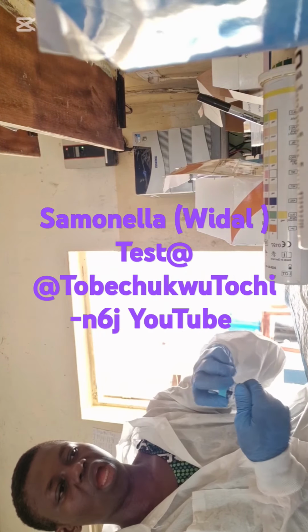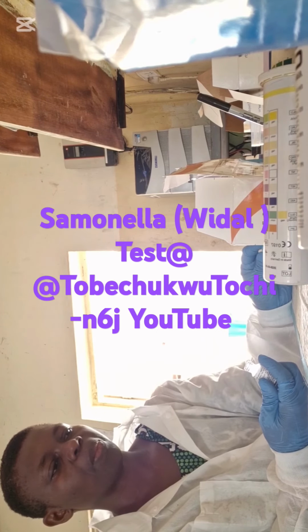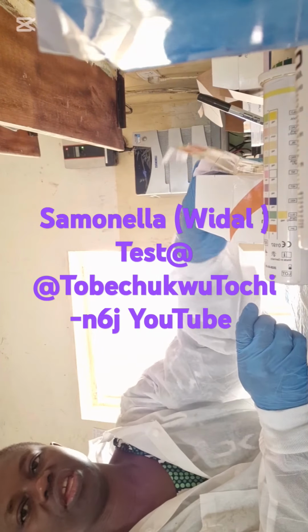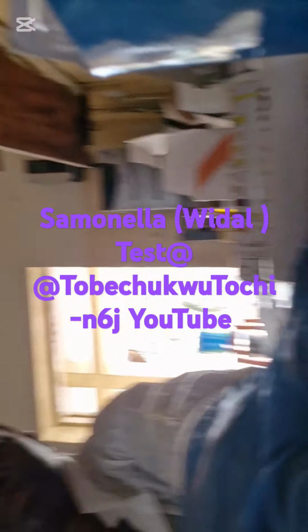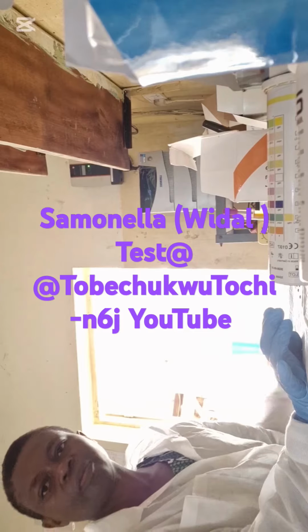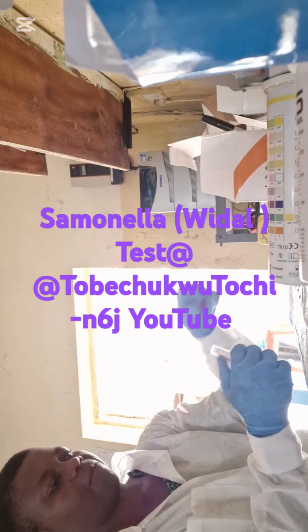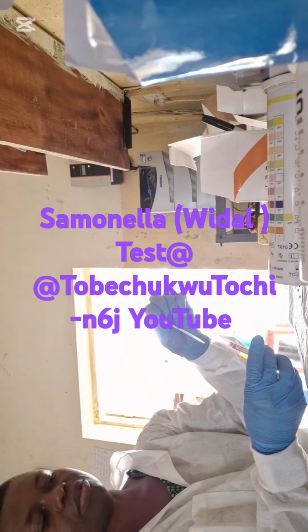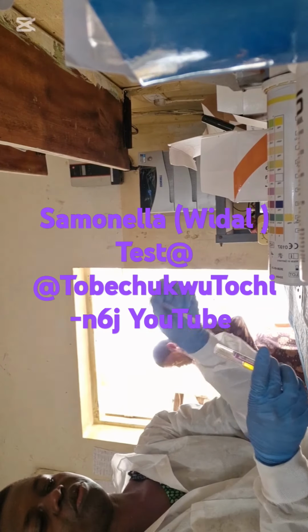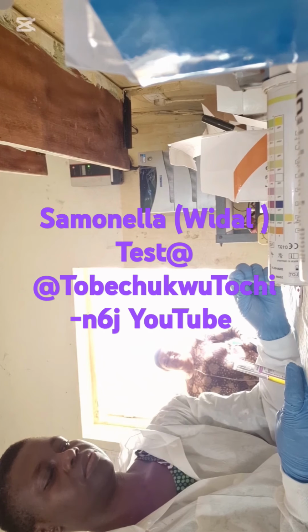So when you put the anti-sera, you add the whole blood, the plasma, then mix. You mix each one and clean, or you use a separate applicator stick. But here I'm using just one applicator stick, so I will mix and then clean intermittently, very well. Then time it for 5 minutes, then rock to see if there will be agglutination.